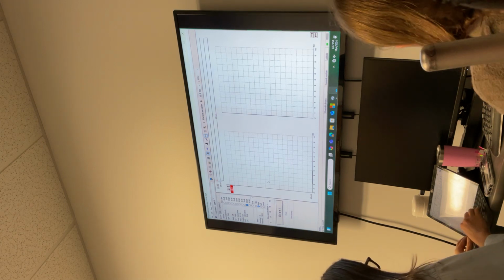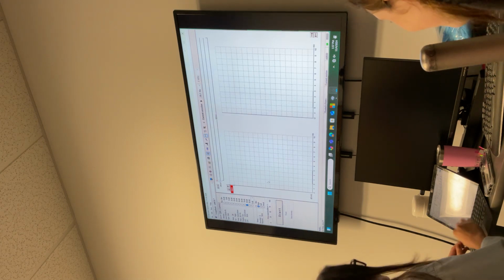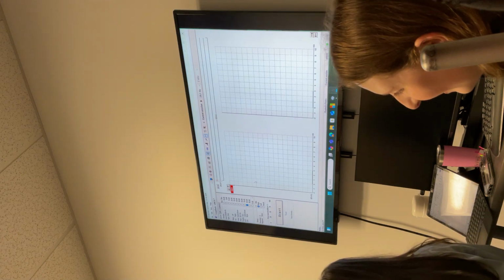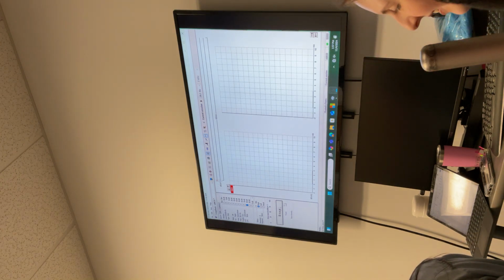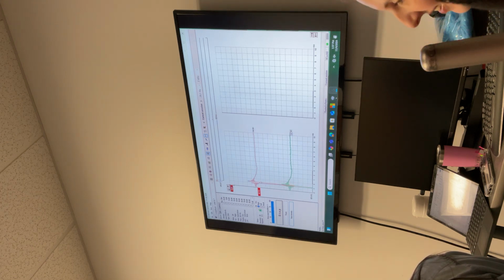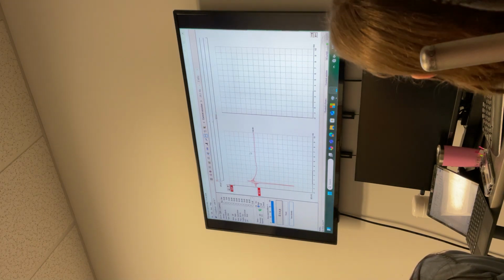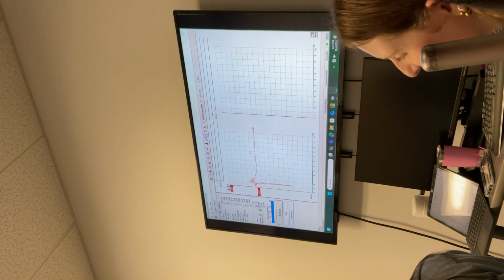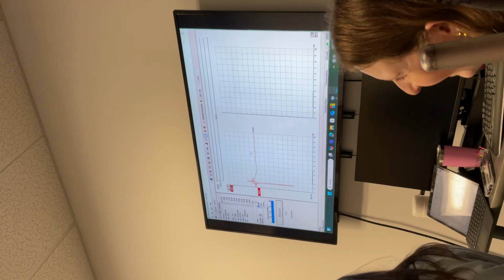You can start a new page. Does the patient need to be connected at all? This is for fun, not part of the chirp. So what polarity is this? That is rarefaction. Natalie, what polarity is this?